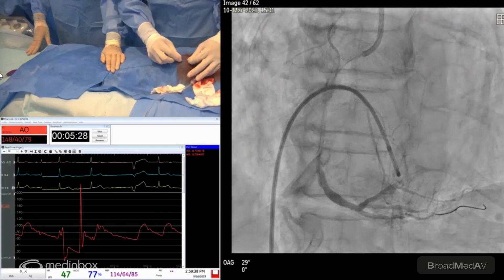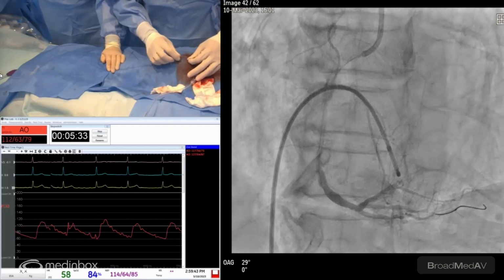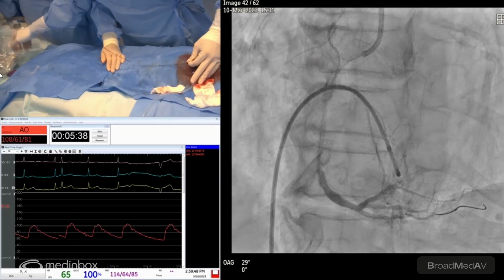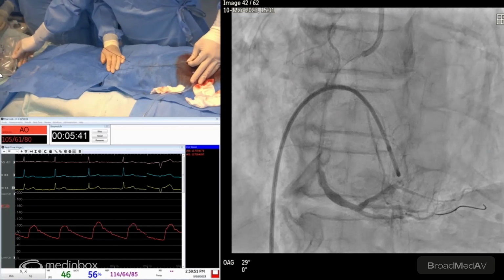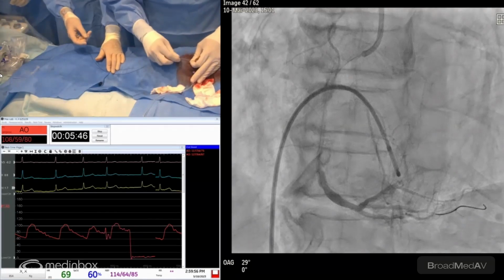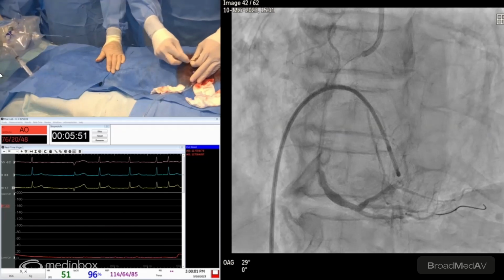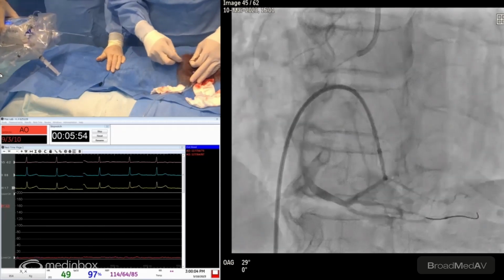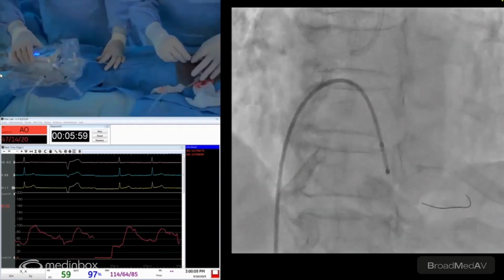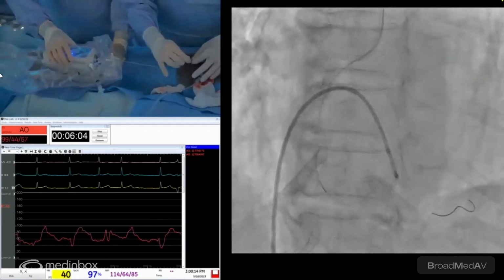Click the manual. Can you just bring it close by? Okay, let's go with the IVUS. What's the ACT? No, the ACT is 276. Okay, perfect. Okay, come closer, come closer. Okay, there you go. IVUS is through.